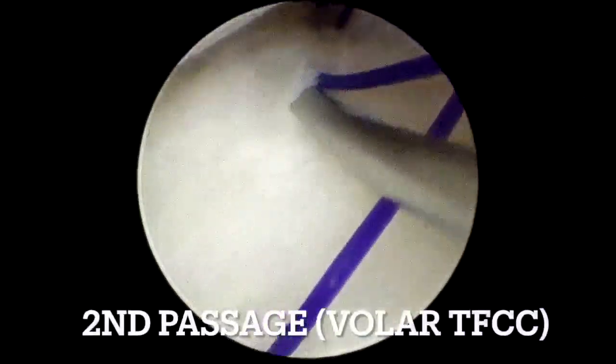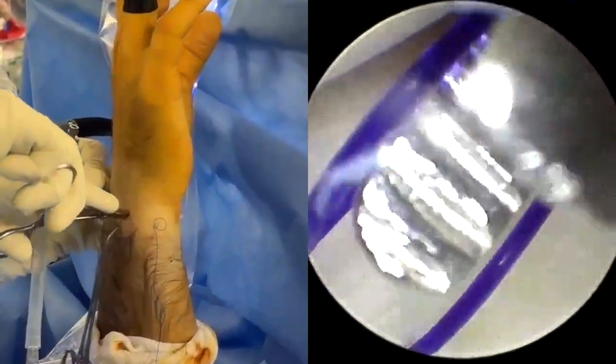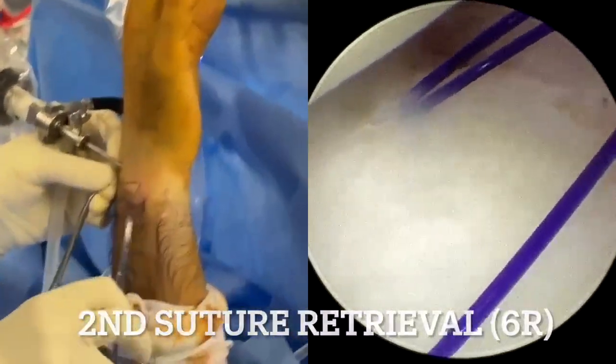Subsequently, the needle is retracted beneath the TFCC and perforates a different section of the palmar TFCC in the same direction, near the styloid recess. The opposite end of the 3-O PDS suture is then retrieved from the needle through the 6-R portal.